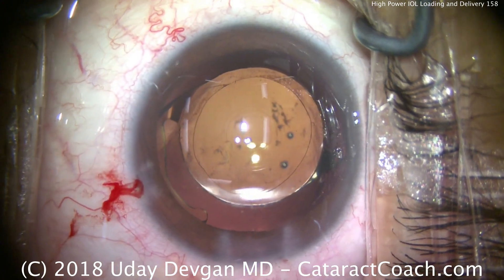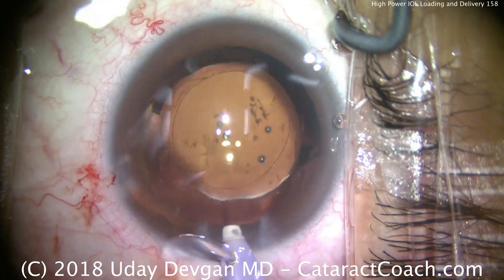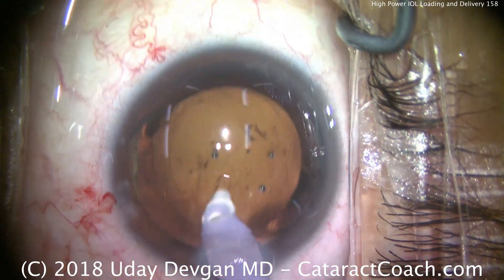There's the lens — looks beautifully centered. Now it's time to clean up, remove the viscoelastic, and do a little polishing of the undersurface of the anterior capsular rim.